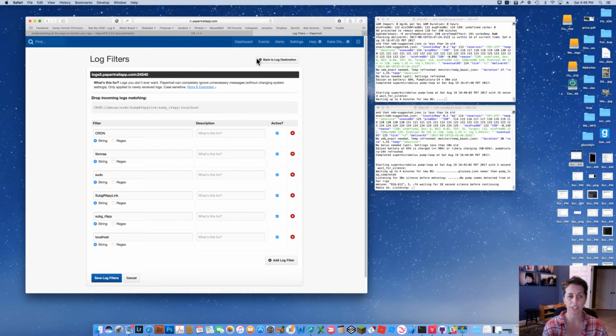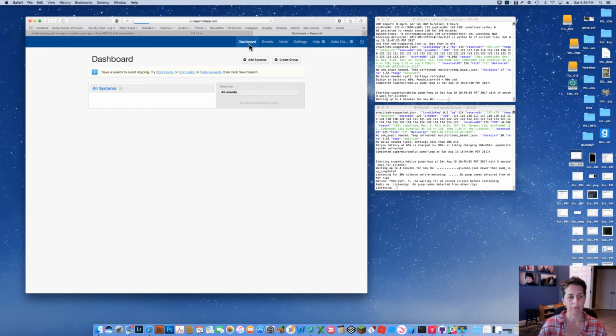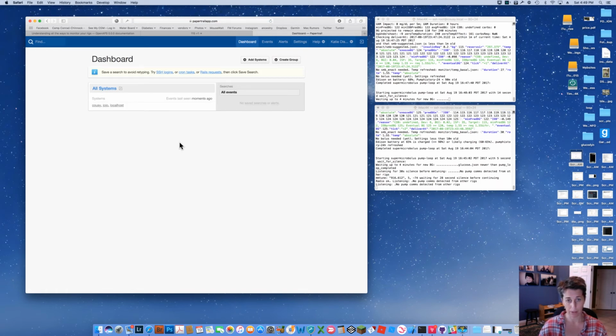And this log filter keeps the information from coming in. This setting here, by having localhost on, it prevents it from even uploading. So that keeps it from counting against my data cap. It just doesn't even make it into my logs, which is how I want it for these ones. So I can cancel out of here. I'm going to go back to my dashboard. So that's a log filter. That keeps things out.